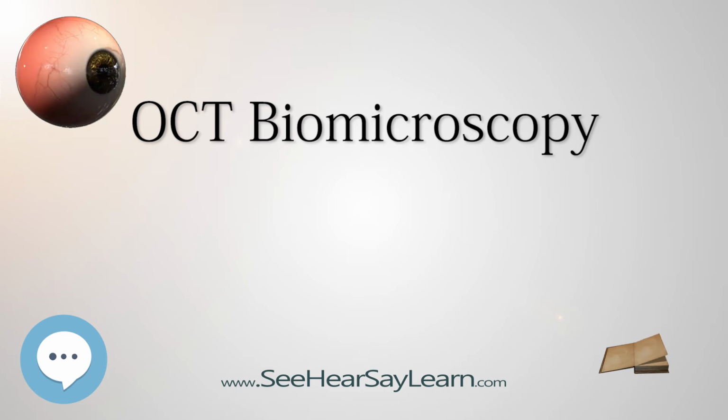Conventional commercial TD-OCT systems are limited to an acquisition speed of 400 A-scans per second with a depth of 2 mm, assuming that an OCT biomicroscopic system must cover a 15 mm x 15 mm planar area of eye tissue with an average depth of 24 mm, 5,400 cubic mm. It would take a conventional TD-OCT system more than 1 day to capture OCT biomicroscopic data on a single pair of eyes.